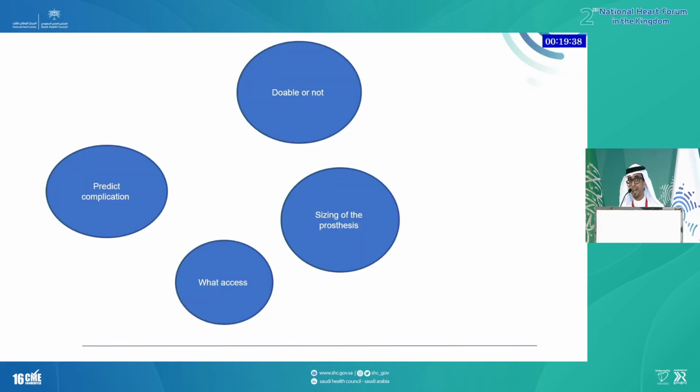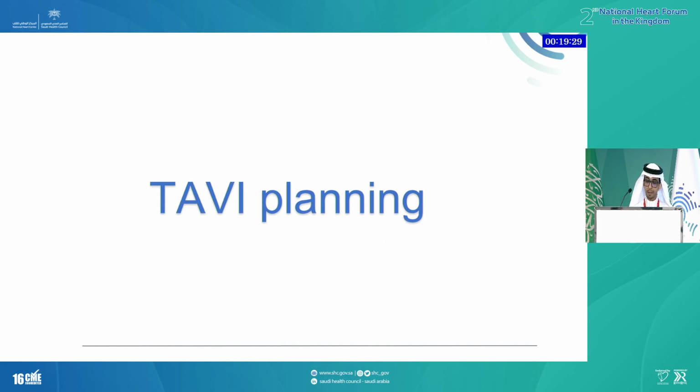To assist the access and also to size the prosthesis. I have no disclosure for this presentation. And we know that the most common percutaneous interventional structural procedure nowadays is TAVI.